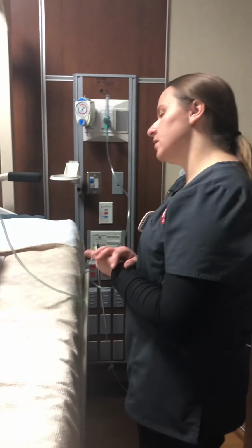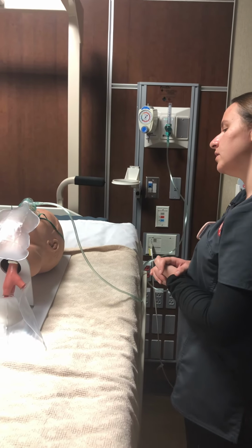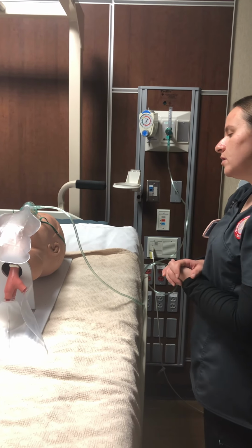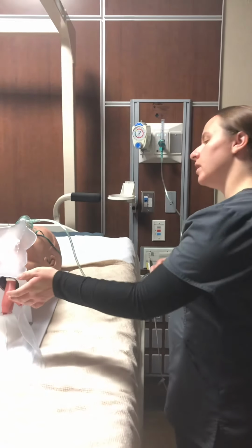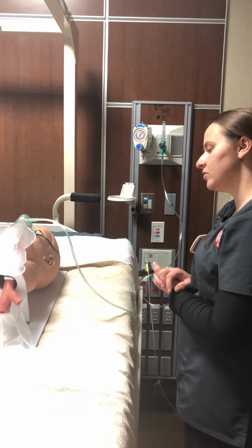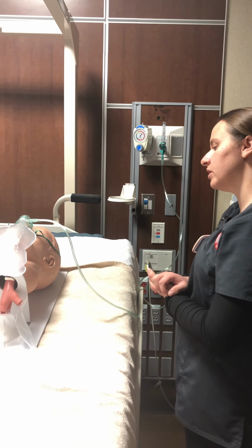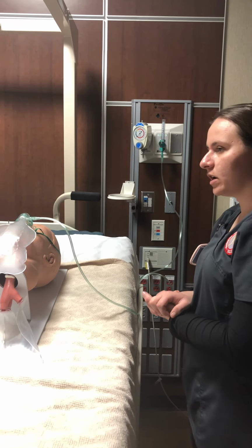So I set out an oxygen, no smoking sign outside. I ask that anybody that comes in here not to mess with any of your oxygen and not to play with your bag here with your non-rebreather, okay? I'm going to come back after a bit and recheck your vital signs to make sure you're getting the appropriate setting.